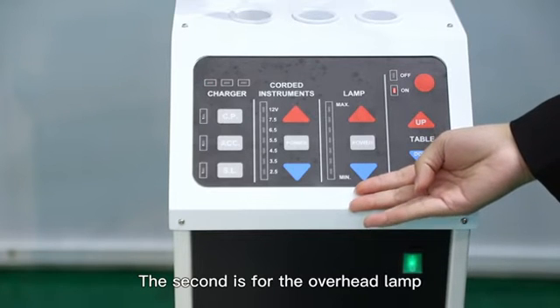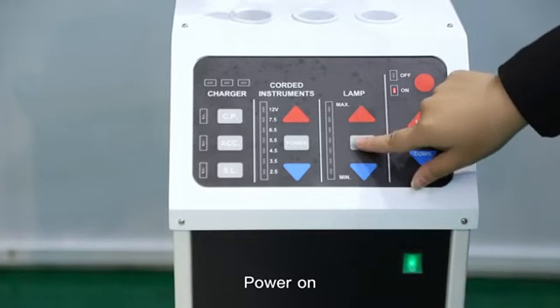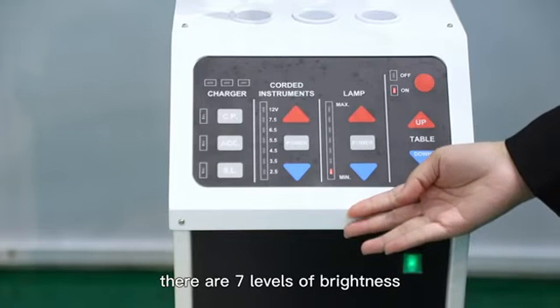The second area is for the overhead lamp. Power on — there are seven levels of brightness.